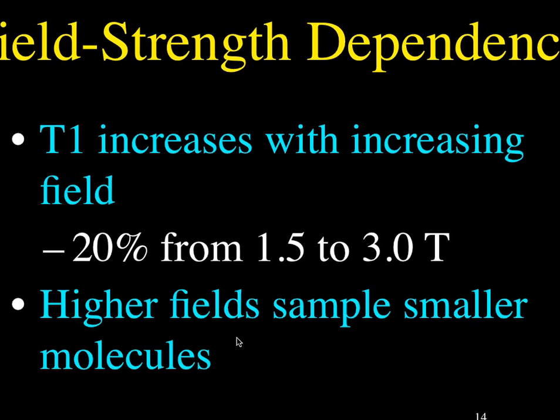There are reasons that are relatively well understood as to why the T1 time changes depending upon the field strength. Basically, the T1 time, another term for which in physics is the spin-lattice relaxation time, is what allows the nuclei in the z direction to go back to the baseline state. They want to go there because that's a low energy state, which we talked about before.